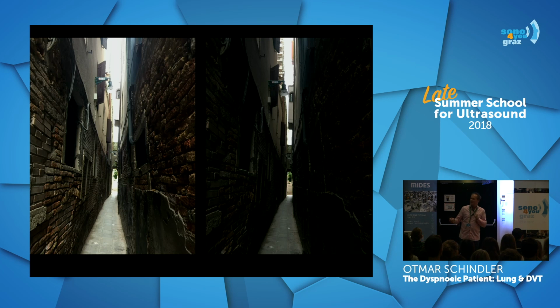It's the focus. You can do that with the iPhone. Put another focus. On this picture, you can see the stairs here, yeah? This picture, you don't see the stairs, but you see the bricks that are here. So you have to point where your focus is.